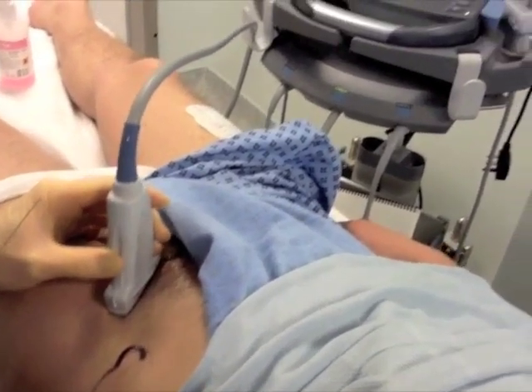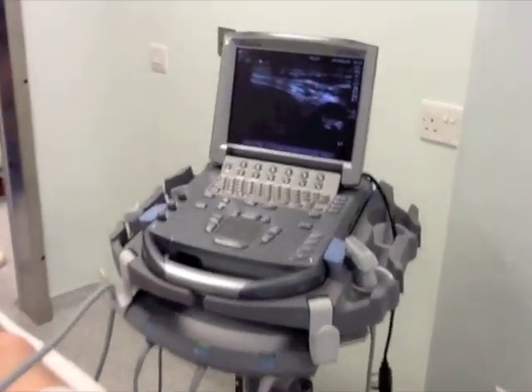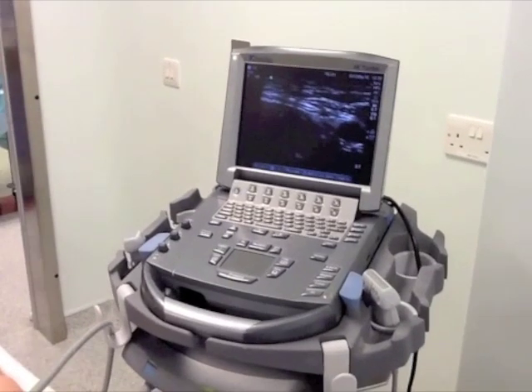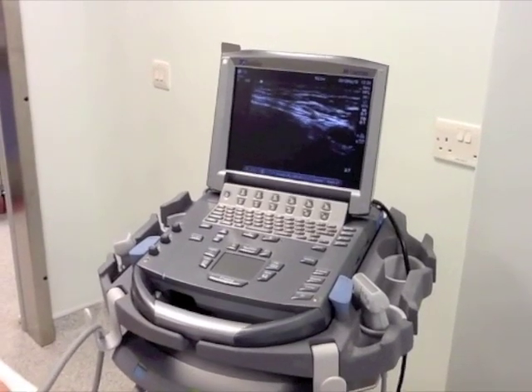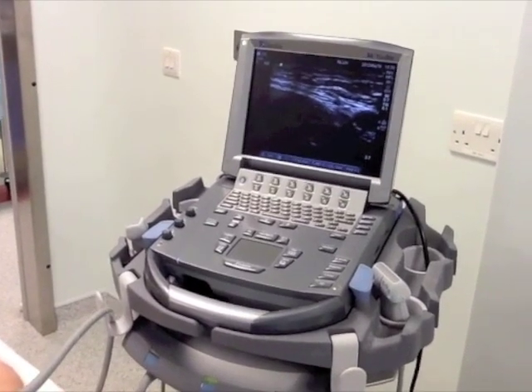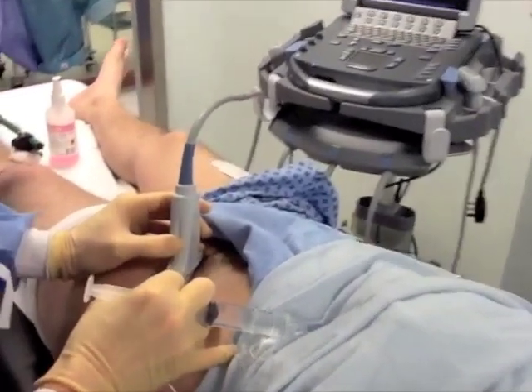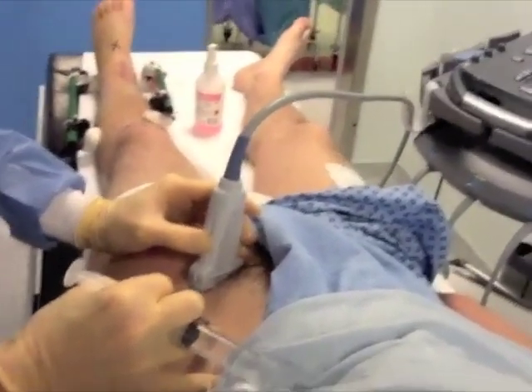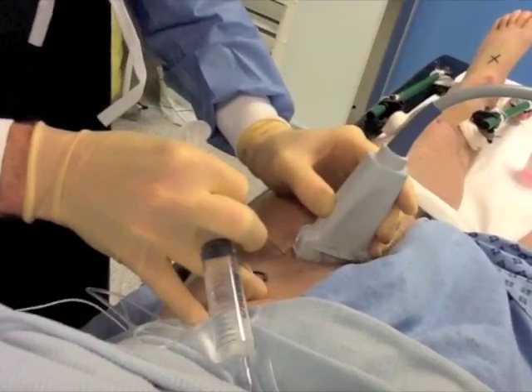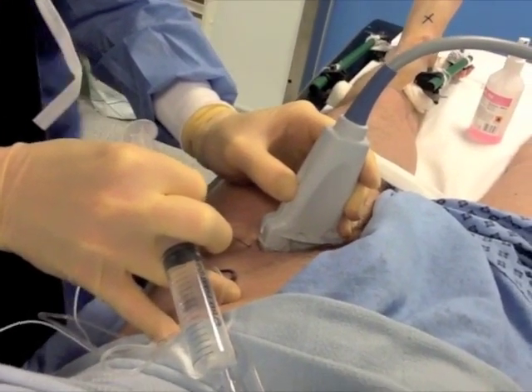The probe is placed just under the inguinal ligament over the femoral artery. The needle is approached from the lateral side of the probe. You can see on the right side of the monitor the femoral artery pulsating. The needle is introduced slightly away from the probe so that the needle does not touch the probe and asepsis is maintained. This is a no-touch technique.